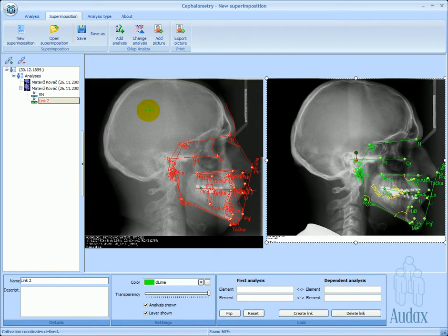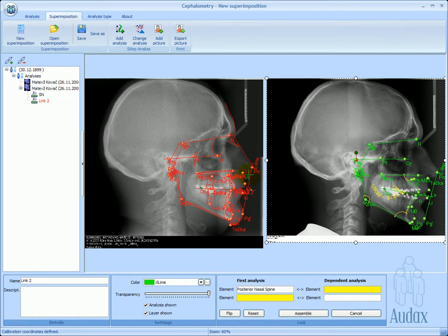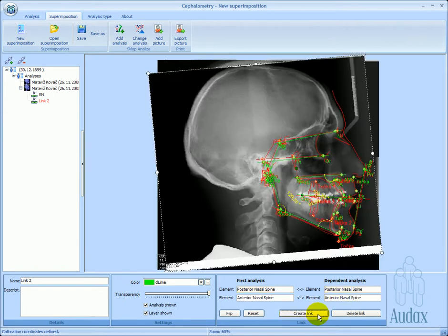Another link is created by connecting, for example, PNS and ANS from both analyses. We can also rename it.